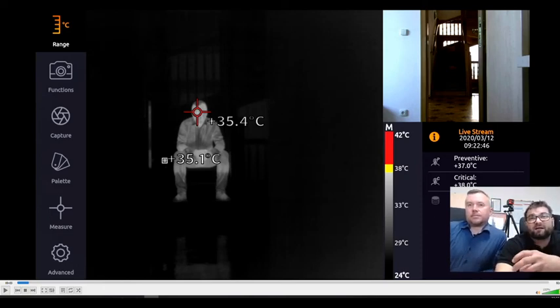The system itself contains the camera and the blackbody source. You can get the view from the camera thanks to an HDMI cable, and you can control the camera thanks to a USB keyboard. So once you get into the camera, you see this menu.